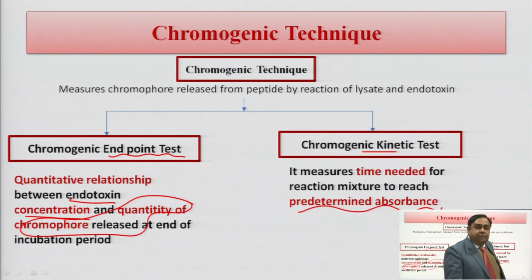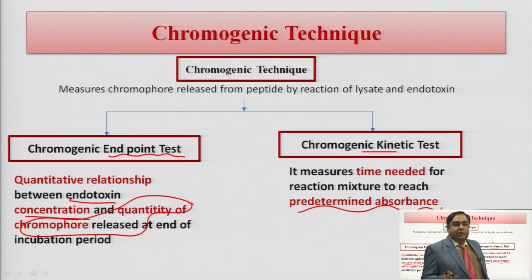That is what we are calling the chromogenic kinetic test. I hope it is clear to you.